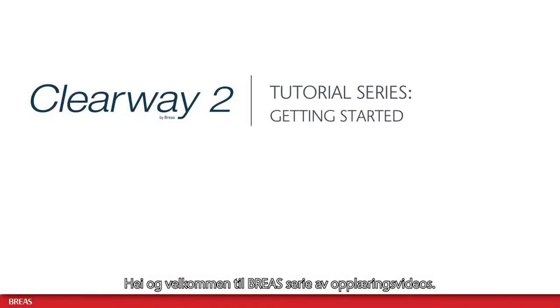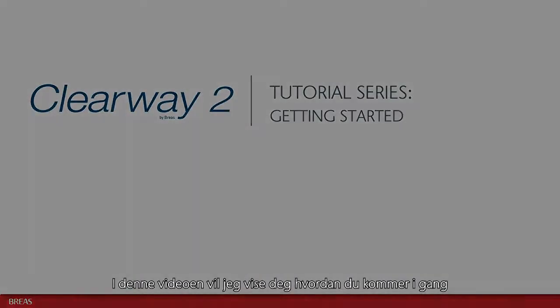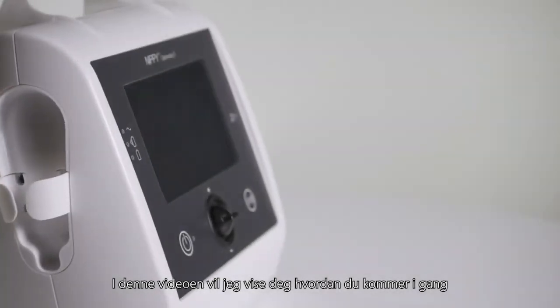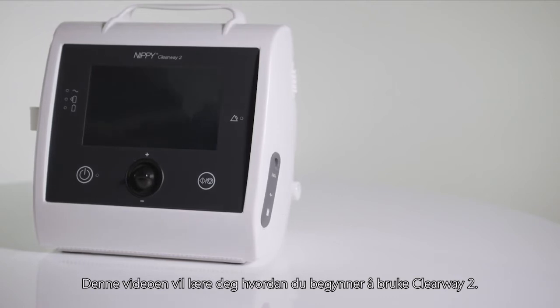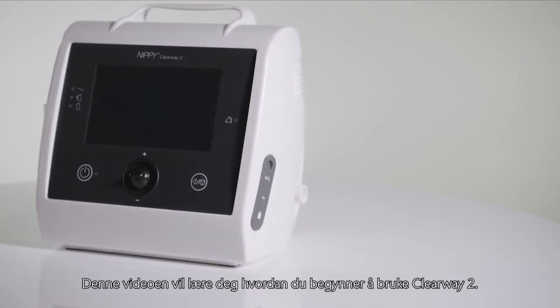Hello and welcome to the Breas tutorial series. In this video I will show you how to get started with the Clearway 2. This video will teach you how to start using your Clearway 2.